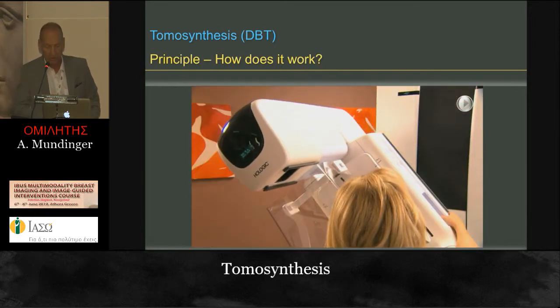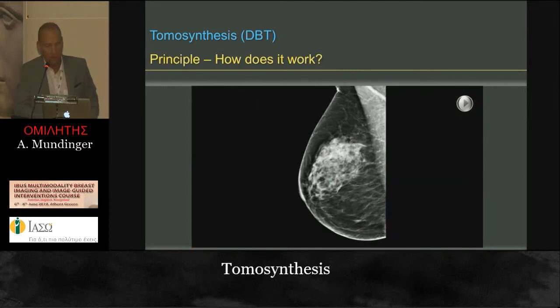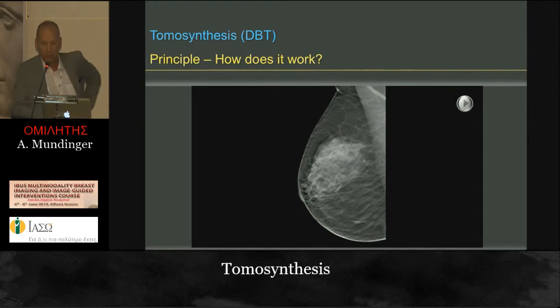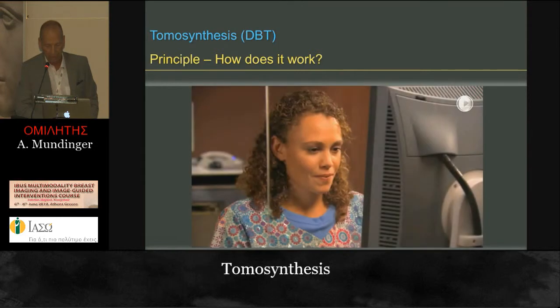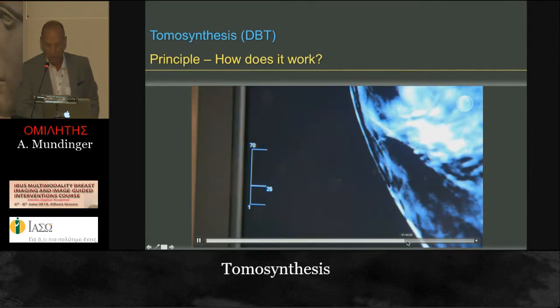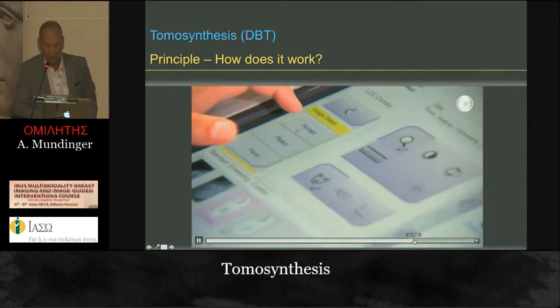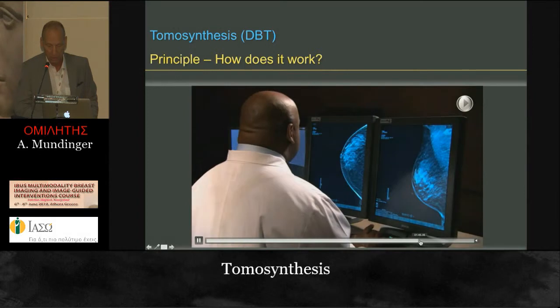And after this, usually the technician scans the images, whether everything is covered, the quality is good. And here you see the typical aspect of a tomosynthesis. And after that, here you see how she moves through these slides. And afterwards, a radiologist does the same and receives these images for final diagnosis.